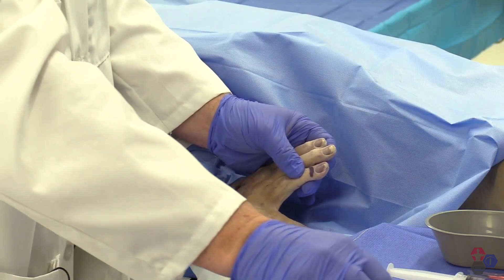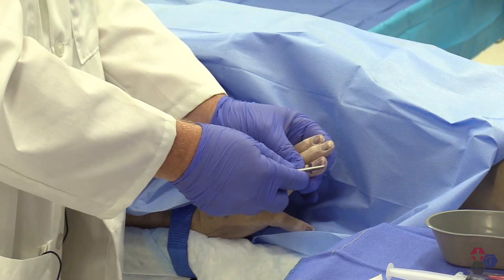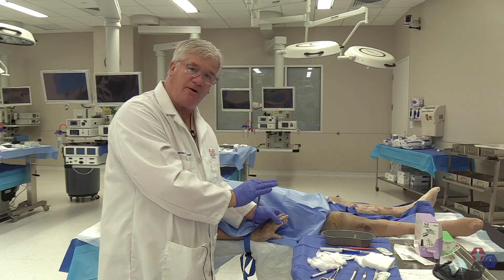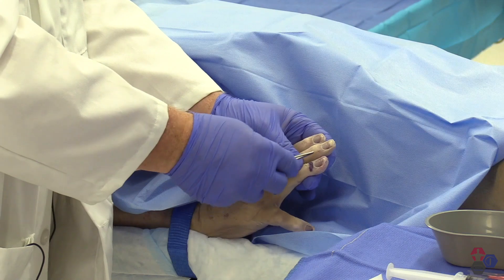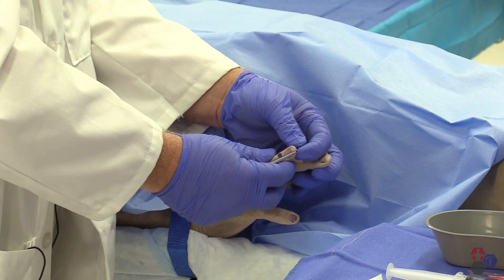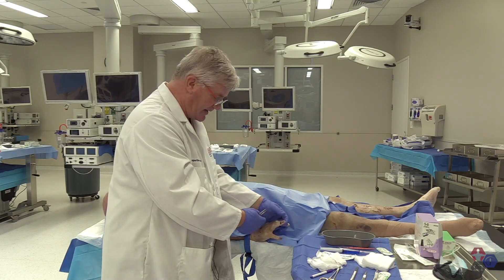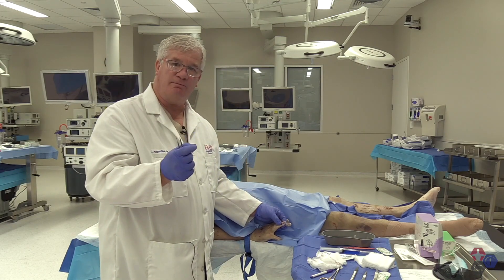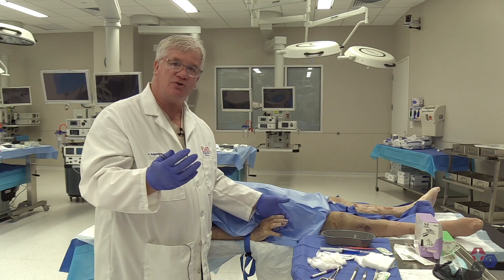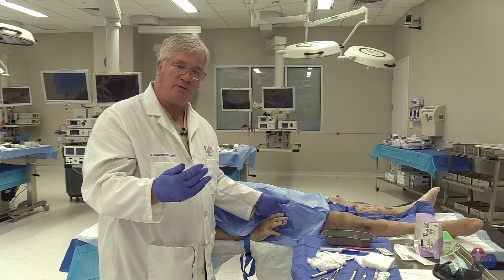Recovering each of the edges around the nail and the nail folds is very important in any repair. Nail bed repair is a separate lecture altogether. For hand functionality, all of the skin needs to go back together. Any viable tissue at the skin tip should be brought back together. Any flaps should be placed with minimum skin tension, then the hand splinted so that tissue has a good opportunity to repair itself and scar in an appropriate position.